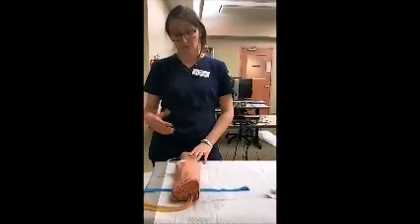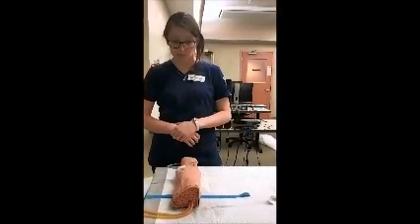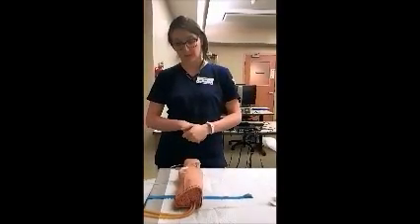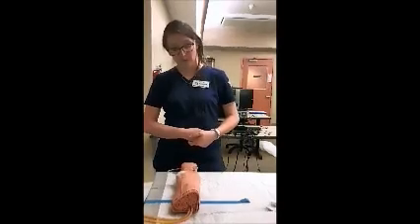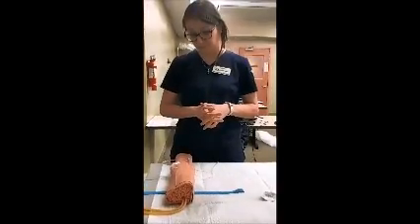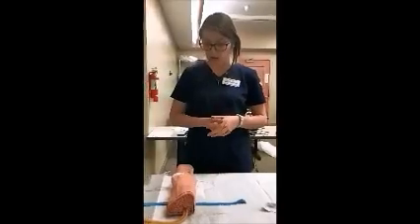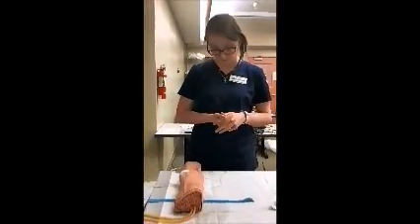Okay. And so if you do want to take a shower, what we'll do is we'll take this tubing off when it's all empty, and we'll do something called saline locking. So we're going to put another piece of tubing on there that'll keep just a little of that saline in there. Keep that IV site ready if we need it. And then I'll put a big plastic bag on your arm so you can take a nice hot shower. Do you have any questions for me, Joe? No, I don't. I'll just watch my show. You just watch your show. I'll be back in about an hour to check in on you again. I got to check this every hour, okay? All right, sounds good.